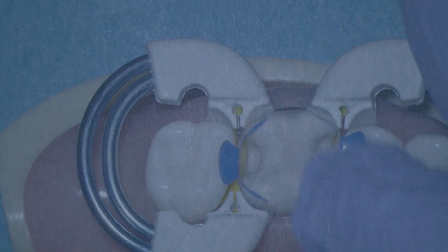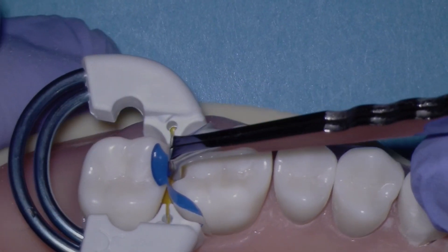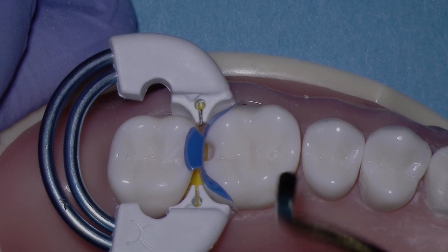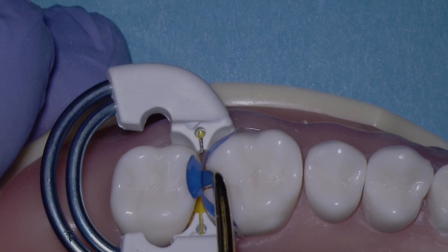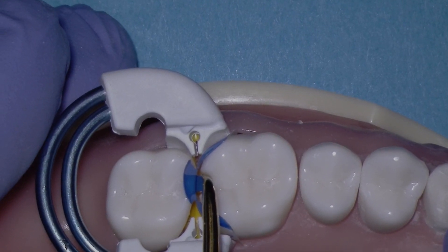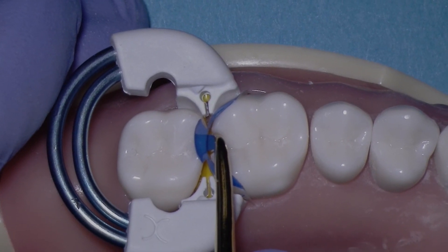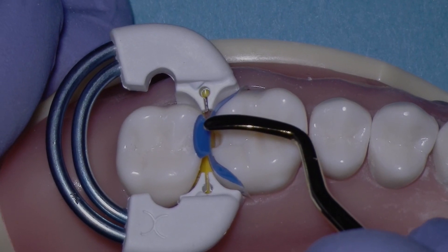Now, let's take a look at a very small cavity preparation. In this case, where we can't even get the small end of the push-pull instrument into the prep, that's when we use the convex end of the Bioclear paddle. It's pretty rare that we have a cavity prep that small, but that is the appropriate instrument for very small preps, or if we're doing a diastema closure in the posterior.